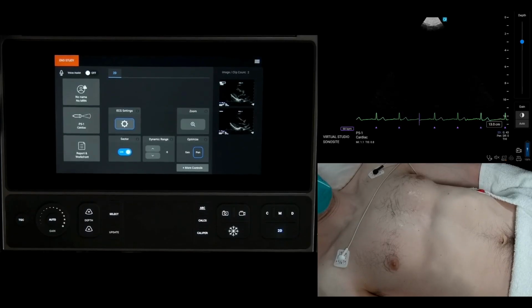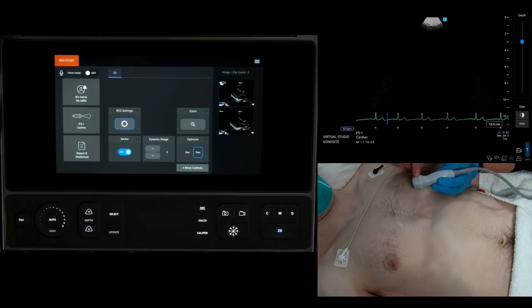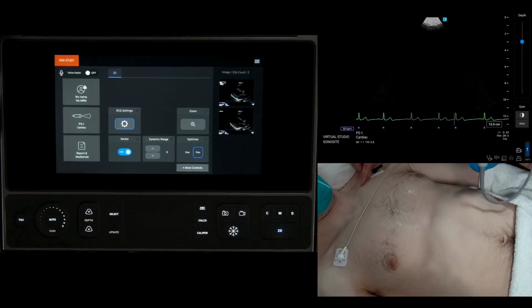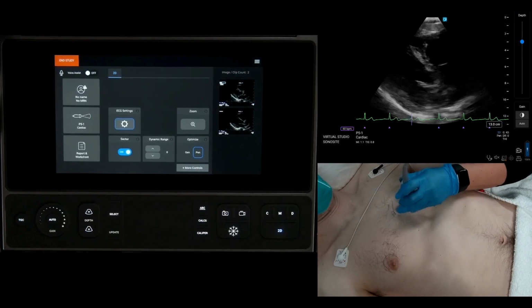In this instructional video, we'll demonstrate how to perform the assisted cardiac output calculation on the Sonosite LX. The first measurement of this calculation is obtained in the parasternal long axis with the orientation marker pointed towards the patient's head and right shoulder. We'll demonstrate this view with the patient in the supine position. However, you may need to roll the patient onto their left side for optimal imaging.